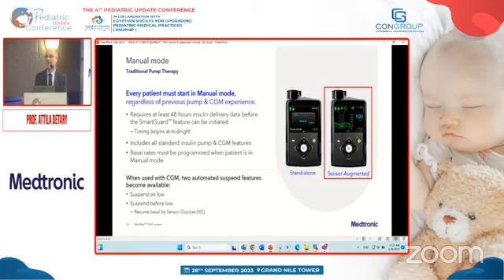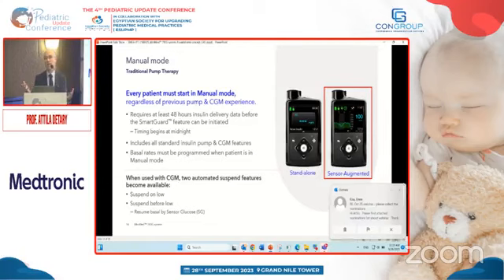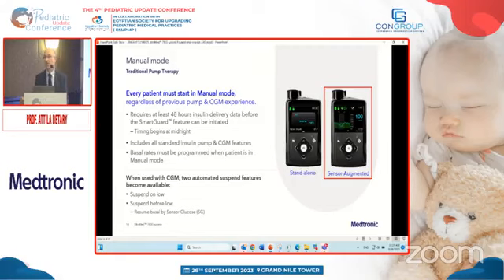And then we have the rest: the carb ratio, the sensitivity factor, the active insulin time. These are also necessary to set into the pump. Here again, the carb ratio is how many grams of carbohydrates one unit of insulin covers. The patient might remember it from the multiple daily injection therapy. If not, then you can use the formula again.